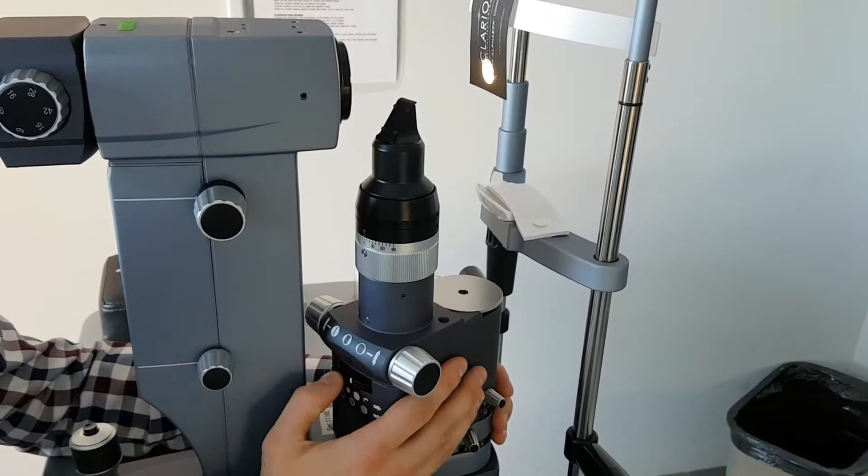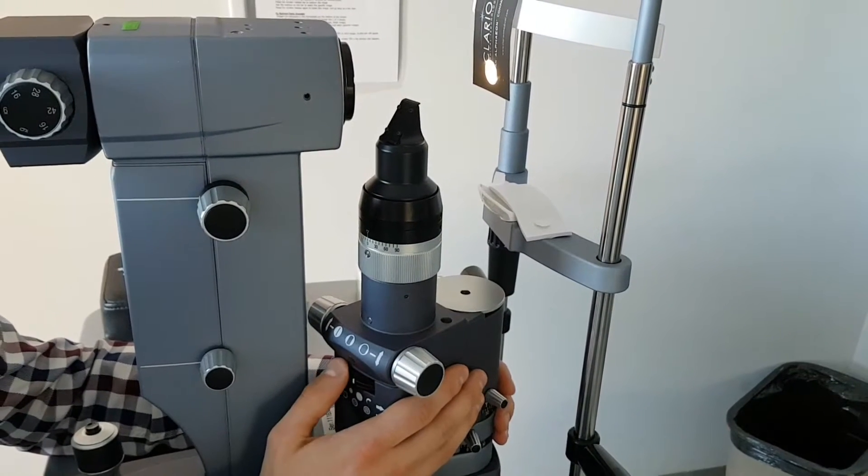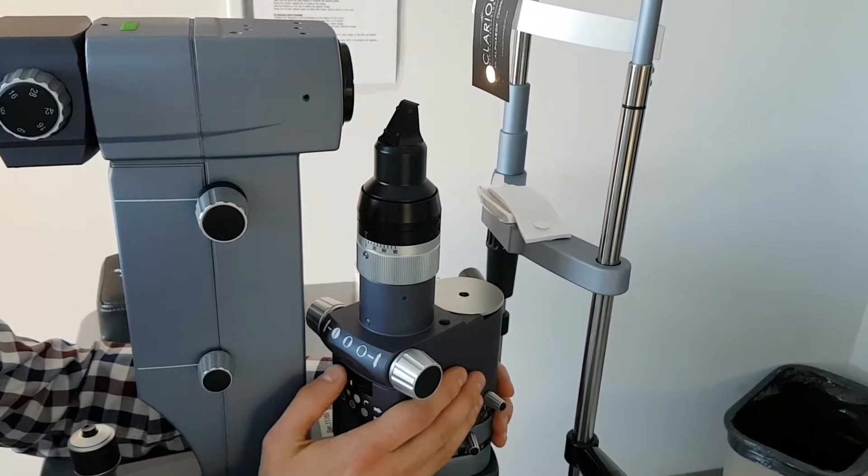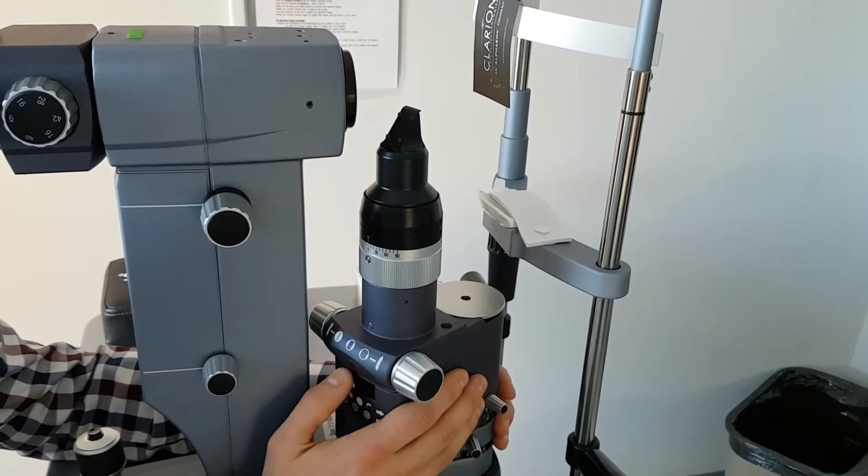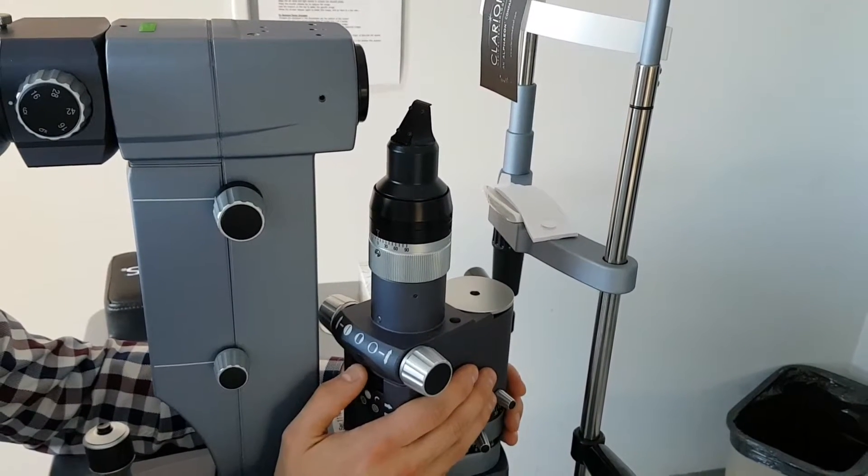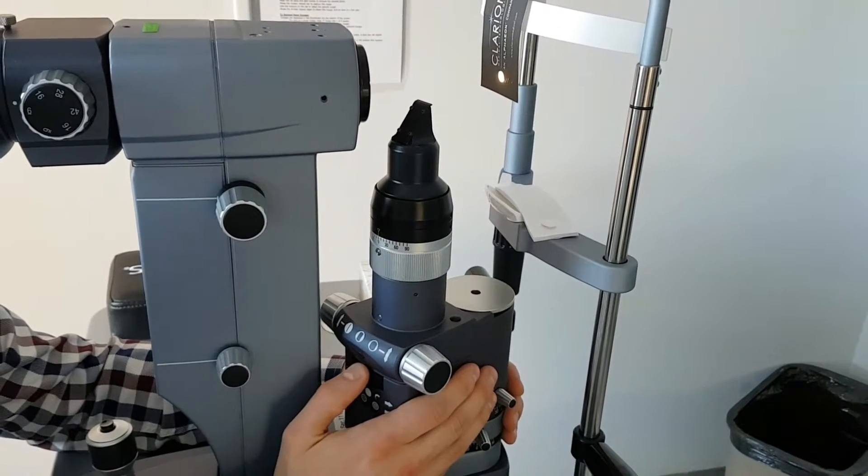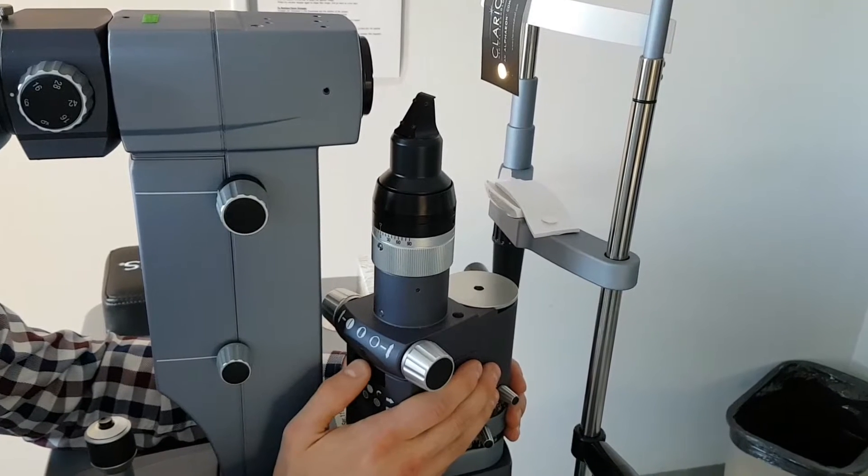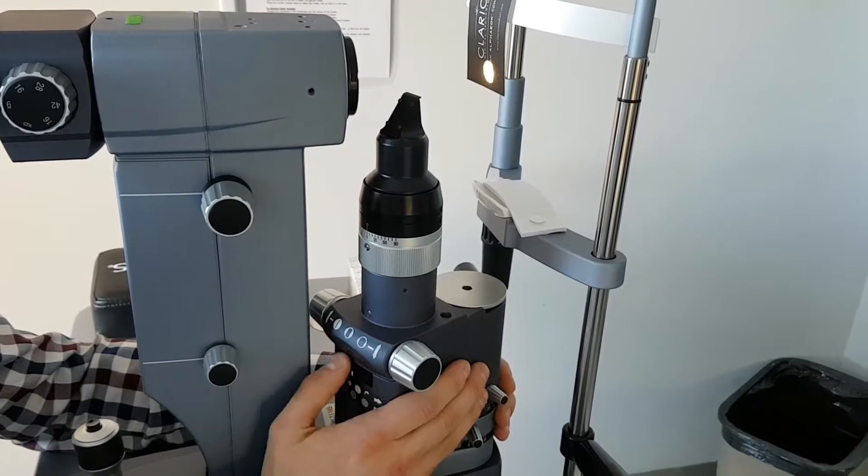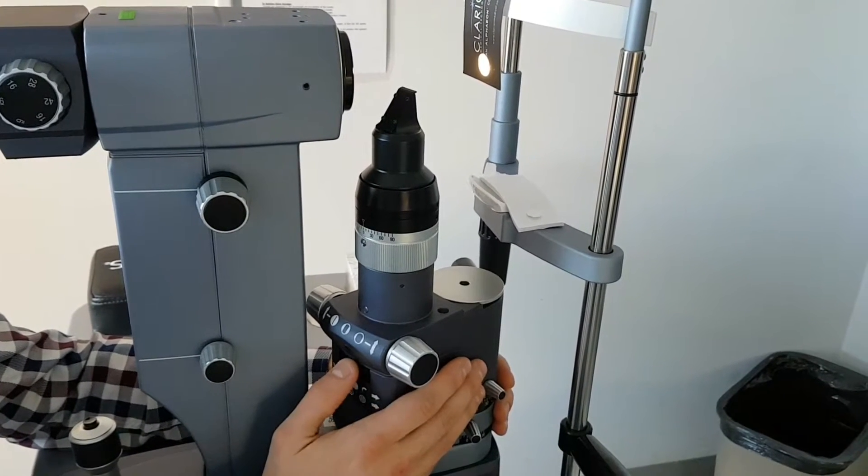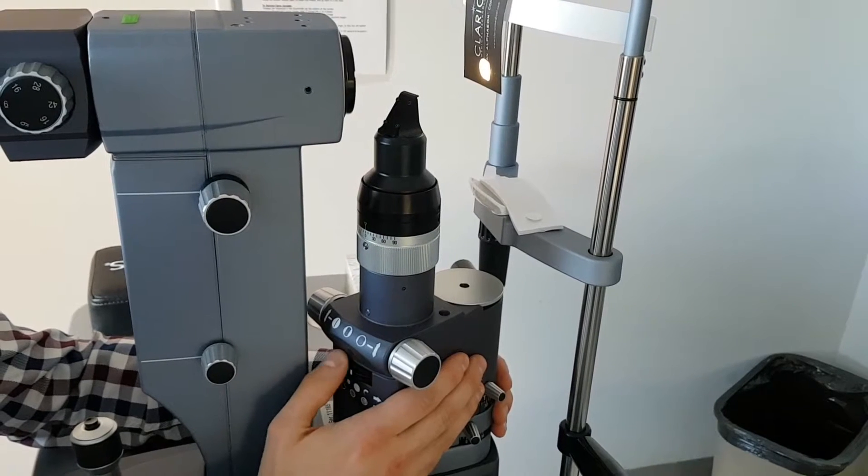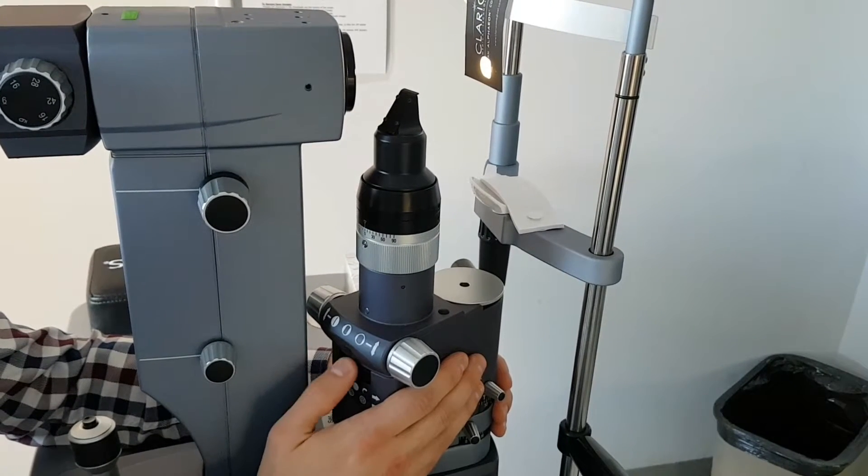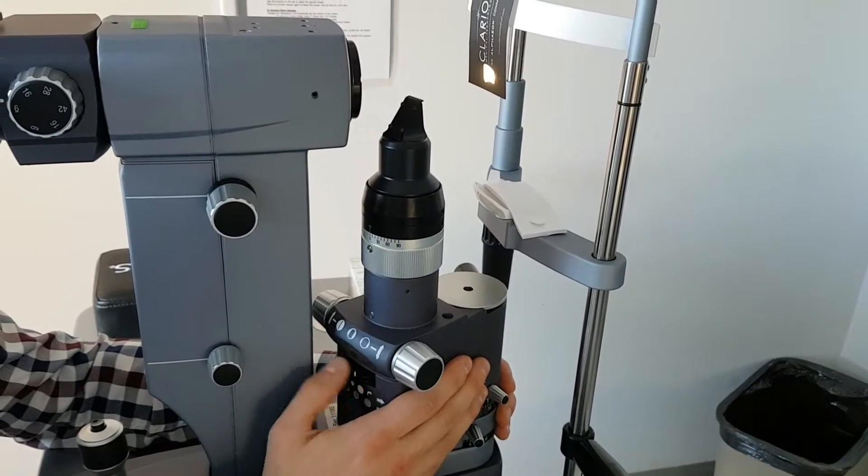The upper wheel is the slit height. It's just different size of circle openings. Typically we use the bigger one. There's a progressive opening, this one here.